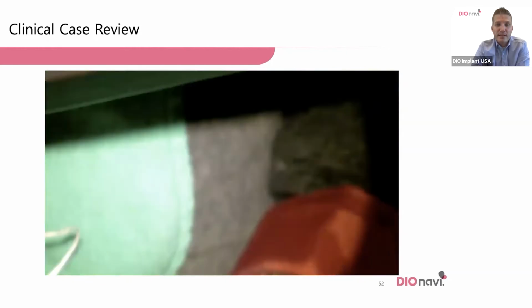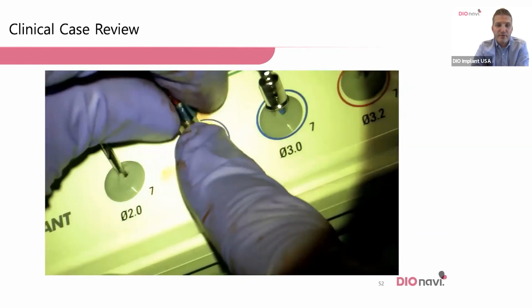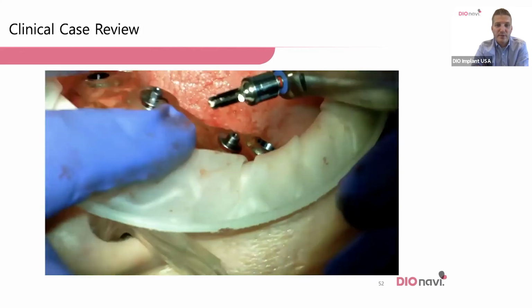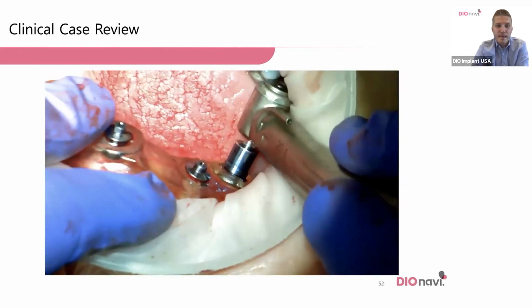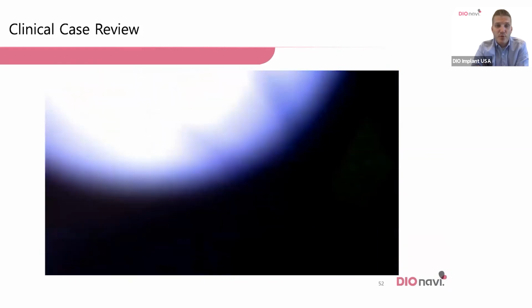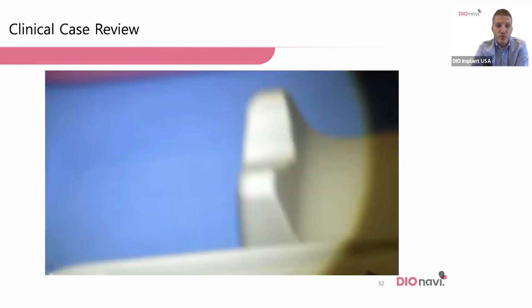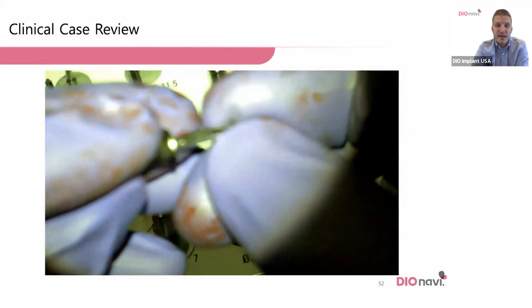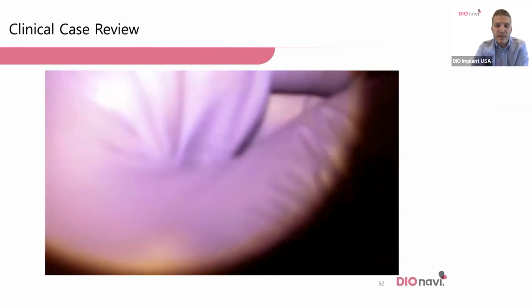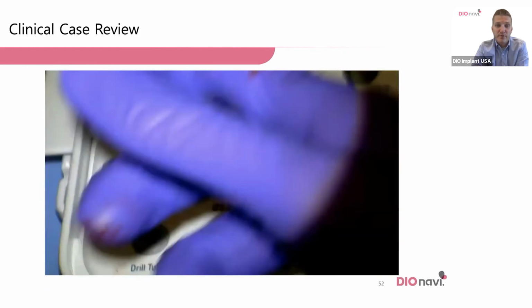And now I believe we'll see, I've got one more drill. This is my 3.2 diameter drill. I'm setting that depth stop again, following the recipe that was given to me. Just widening the osteotomy now to 3.2. With the osteotomy now at 3.2, I'm going to go to the sinus kit and grab my sinus drills. I'm just checking to make sure it's the right length. This is the 17 length with a depth stop. Looks like the pink one's the right one.